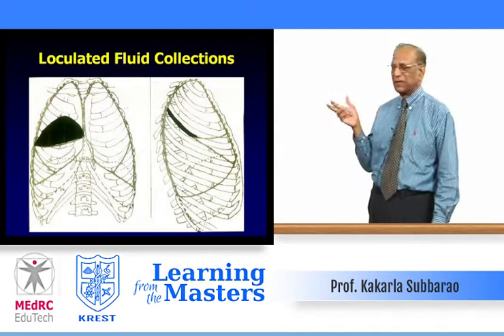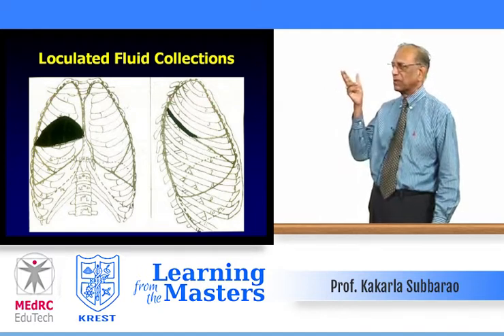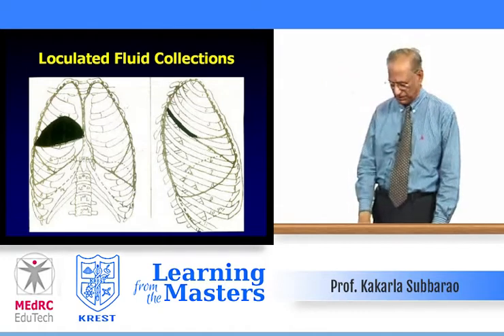Just a diagrammatic representation of a pleura, oblique fissure in the lateral view and in the PA view, how it simulates the transverse fissure.